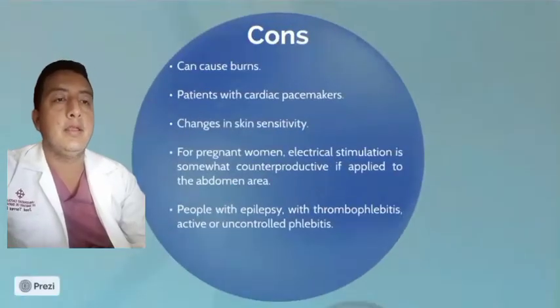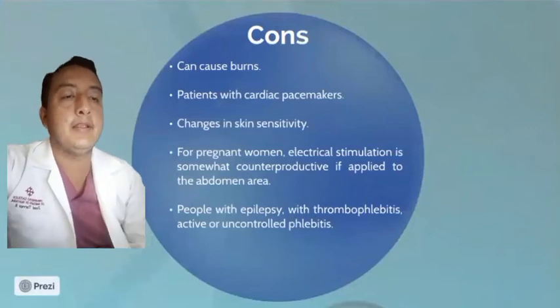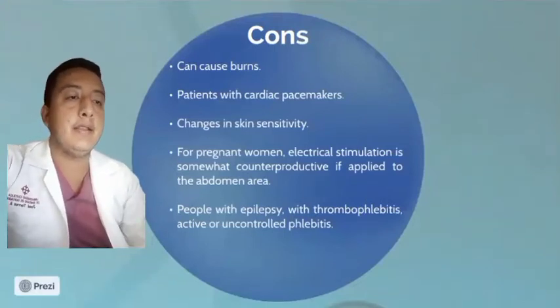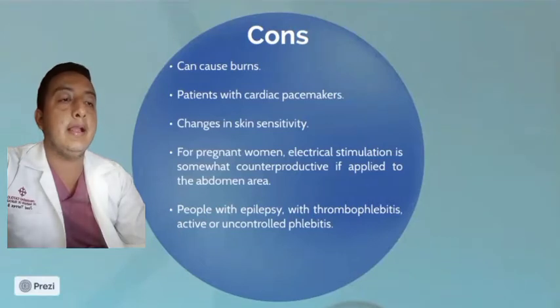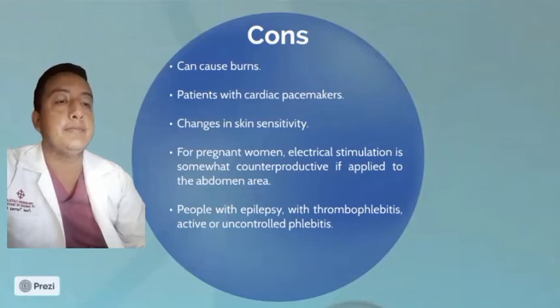Cons: can cause burns, patients with cardiac pacemaker, change in skin sensitivity. For pregnant women, electrical stimulation is somewhat counterproductive if applied to the abdomen area. People with epilepsy, with thrombophlebitis, active or uncontrolled phlebitis.